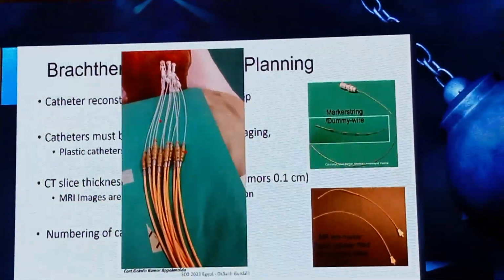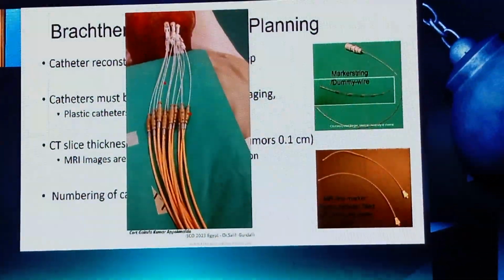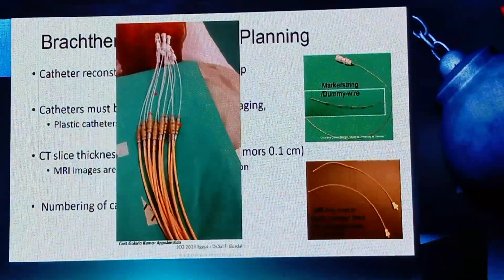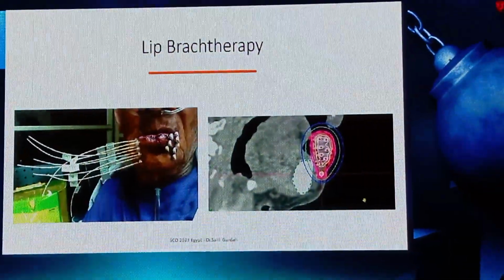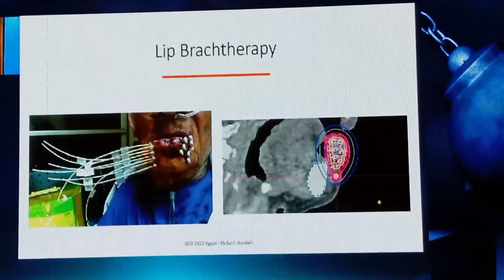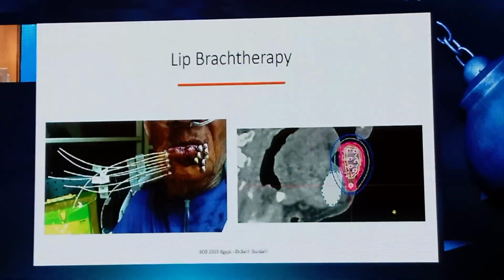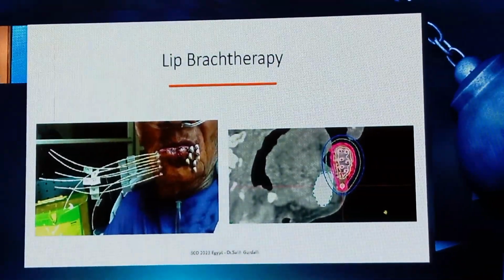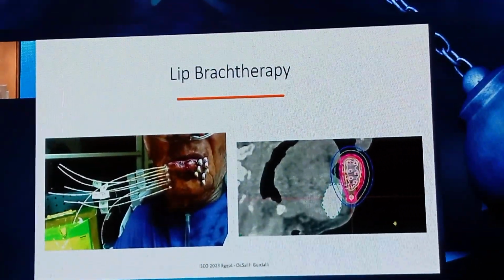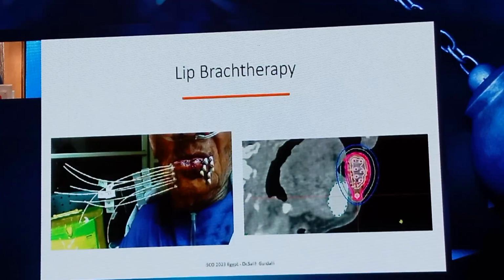Some companies have numbered catheters. It helps you number the catheters much more easily because they have numbers on them, and you need to align those numbers with the extension cable. Sometimes the device or catheter that you are using doesn't have that option, and you need to number them by yourself. I have some recommendations here. This is the trick of the trade in planning. After you number them, everything is going to run on this numbering system every day. If it's 9 fractions, 10 fractions, the patient has to keep these numbers.